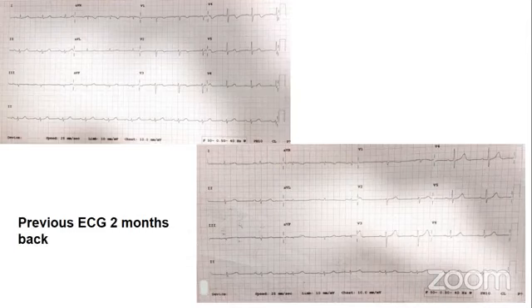But I warn you of a few things. False Wellens can be possible, particularly in LVH. In LVH, sometimes with a little bit of adrenaline surge, such as cocaine, it may look like Wellens, but it is actually false Wellens. We need to recognize that. That is not common, but mostly if the patient has ischemic chest pain and you have no other explanation like associated LVH or any valve disease with LVH, then this biphasic nature of the T wave with chest pain is ischemic.